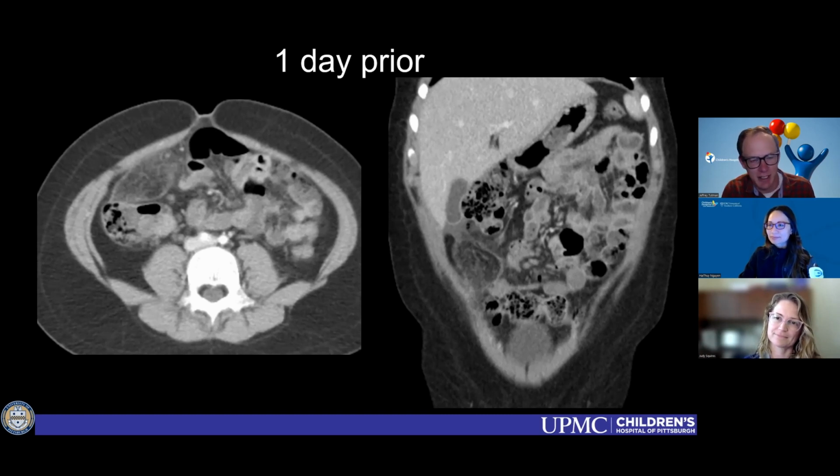I would say our main layer of recognizing these is probably with our sonographers. I think they're pretty on top of things. They do a good job of looking at the history when they see an ultrasound request, and they'll often be the ones that notice there was a CT done, and they will ask us, do we really need an ultrasound? This patient had a CT that showed these findings. But we don't have much formal in the way of policies that I'm aware of that would catch these things.